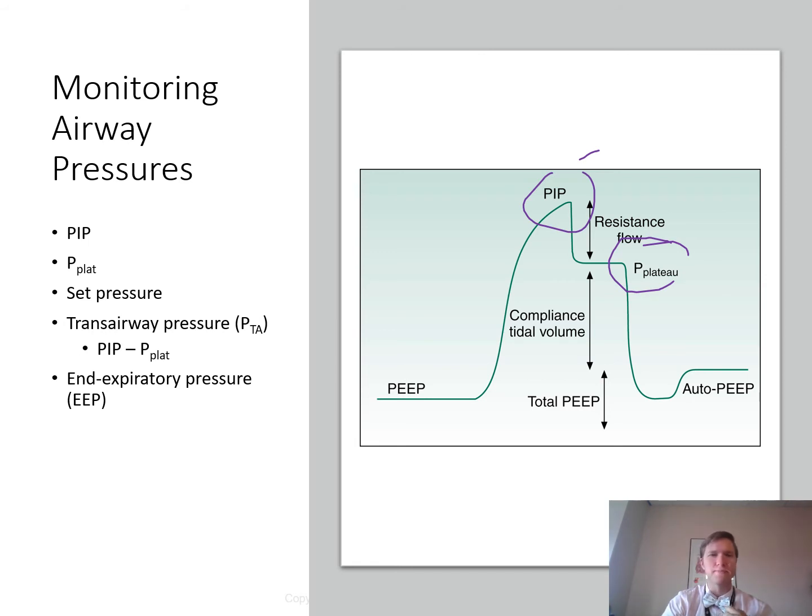Alveolar mean pressure. So when we're looking at this, if I'm trying to improve tissue oxygenation, and let's say a patient has a lot of atelectasis on their chest x-ray, right? One of the things I can do is increase their I time, increase their total cycle time, right? I can increase these things to help effectively recruit alveoli and improve them with just mean airway pressure instead of increasing tidal volume, right? So if I increase PEEP and increase mean airway pressure, then that might actually help optimize alveolar pressure, which helps with diffusion of gas into the bloodstream. Right, so it might help with tissue oxygenation.